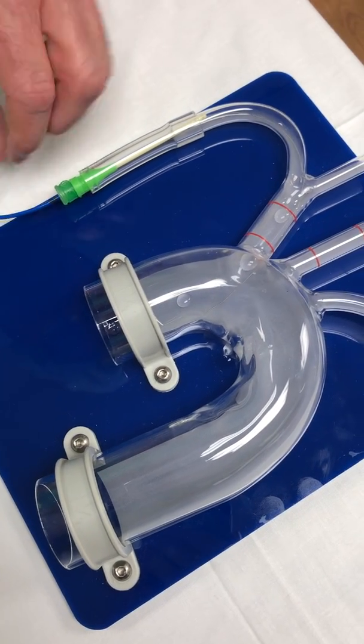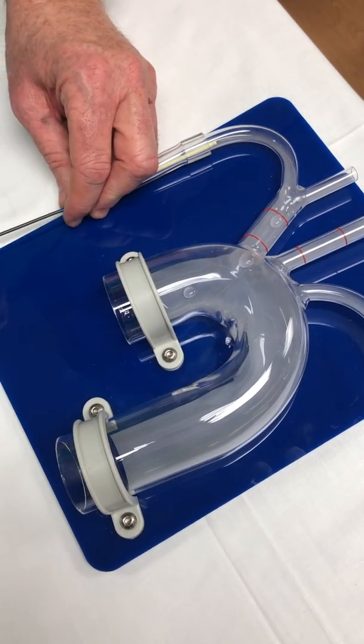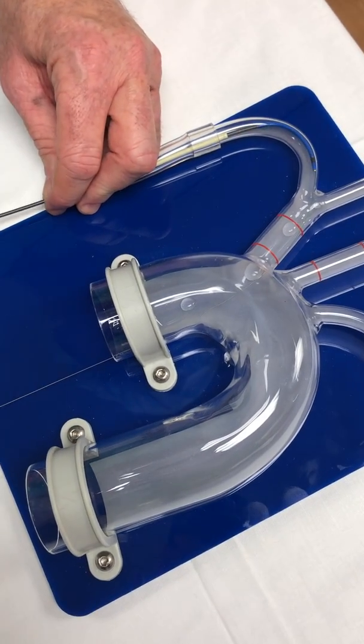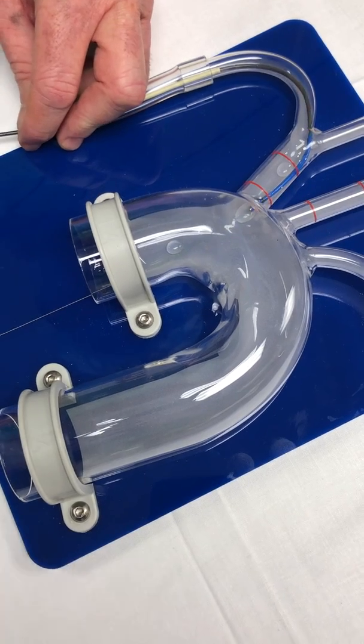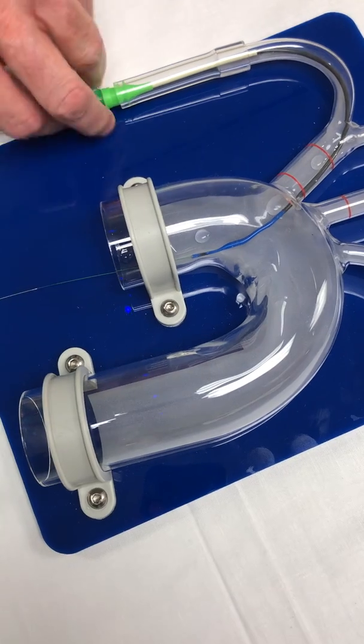Once that's there, someone's going to hold the wire and we're going to start advancing the catheter. We'd be doing this under fluoroscopy so we can see, and there are really good markers on this device. Once you see the red lines, that's where we're wanting to place that proximal filter — ideally right between them.